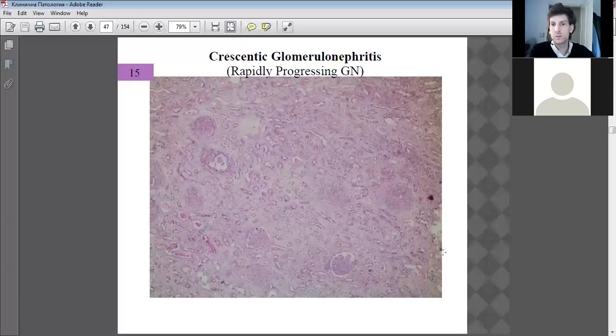This is necrosis. Can you see the darkened areas here? This is definitely necrosis. And all sorts of problems can result, including death of the patient. Okay. All right. Any questions on that, sir? No, we can move on. Good.